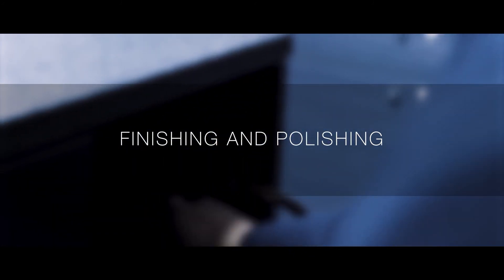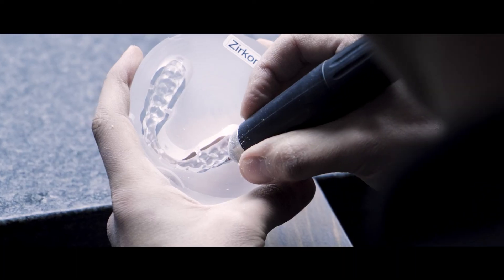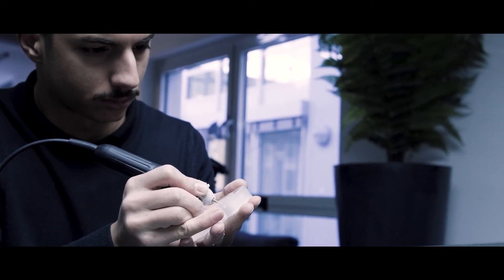Once the milling is completed, we separate the restoration from the blank. We perform the manual finishing with tungsten carbide burrs and proceed with the final polishing.